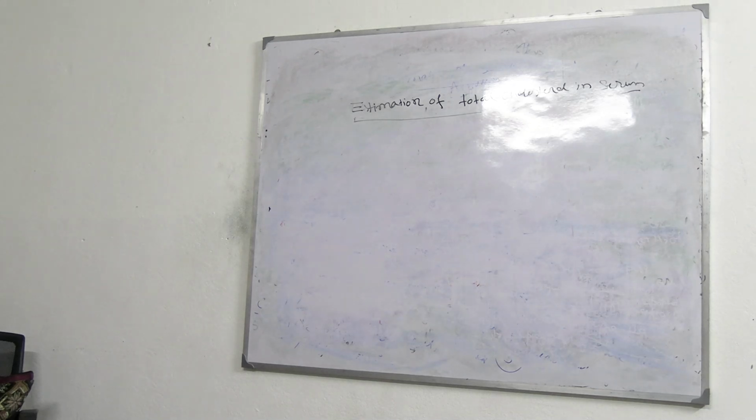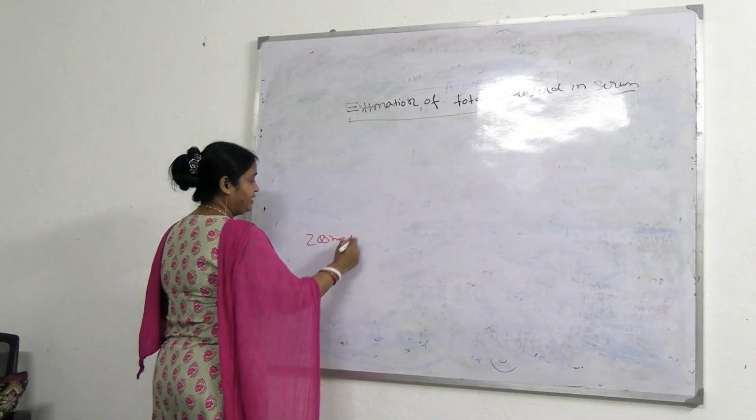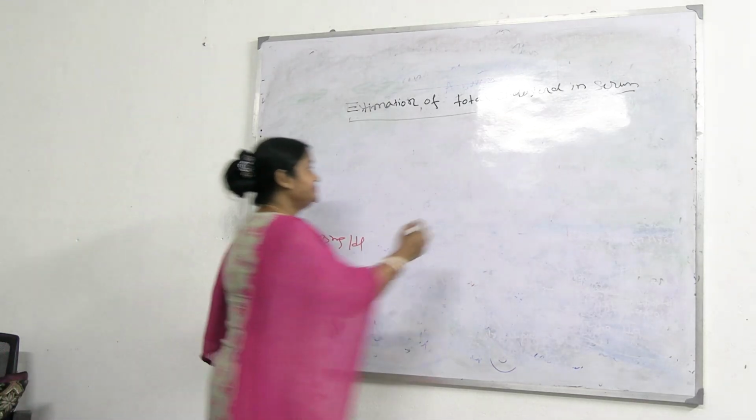Now regarding the procedure and the reagent, there will be L1 and L2 reagent, and there will be one standard. The standard has a cholesterol level of 200 milligram per dl. Whatever standard is given, that concentration will be 200 milligram per dl.